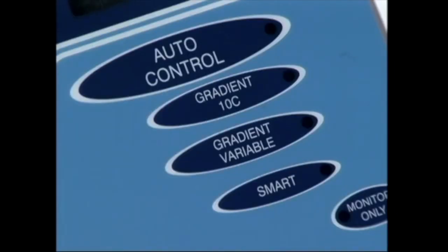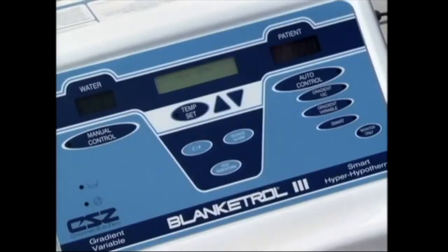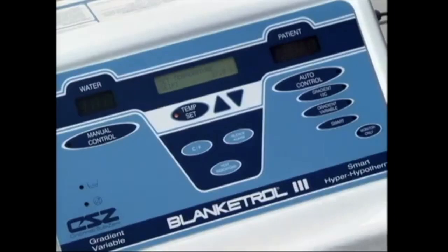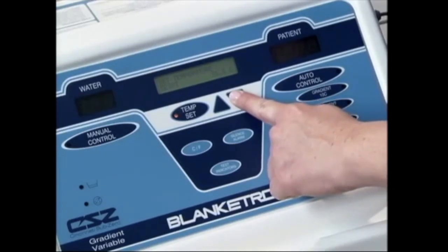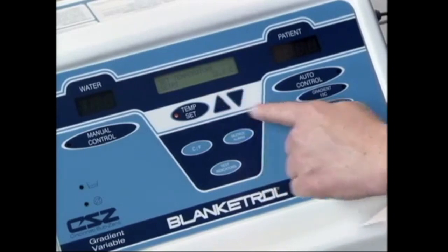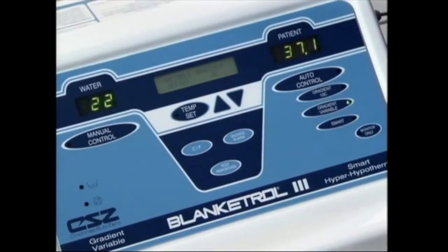To use the Blanketrol 3 in the gradient variable mode, all you need to do is make sure that you have a temperature sensing probe in your patient and it's attached to the Blanketrol 3. Then press the temperature set button in the center of the console. Using the up and down arrows, enter the desired goal temperature for your patient. When the desired temperature is entered, press the gradient variable button. In the center console, it will show variable gradient offset — 0 degrees C. This is where you will enter the gradient variable offset that your hospital has desired in its protocol. Using the up and down arrows, enter the desired gradient variable offset for your institution.